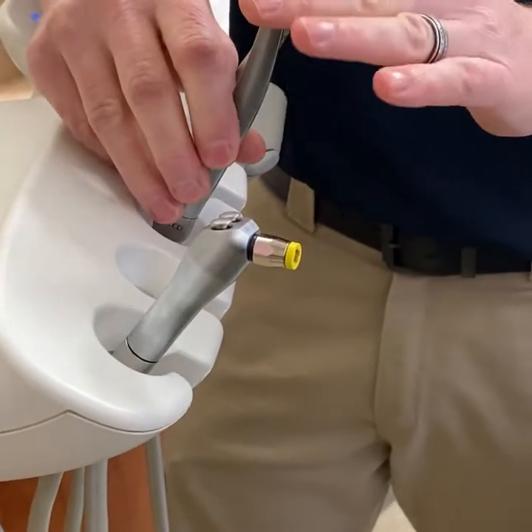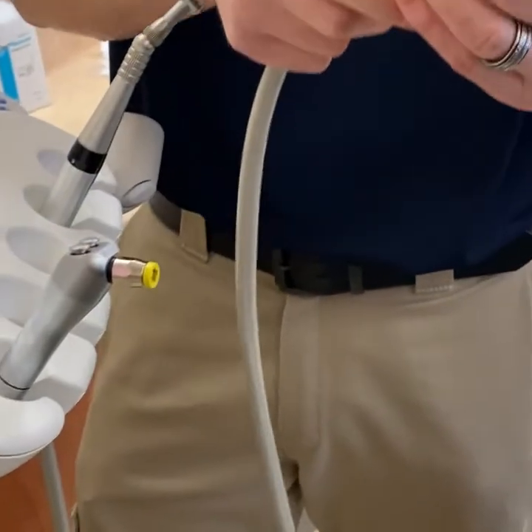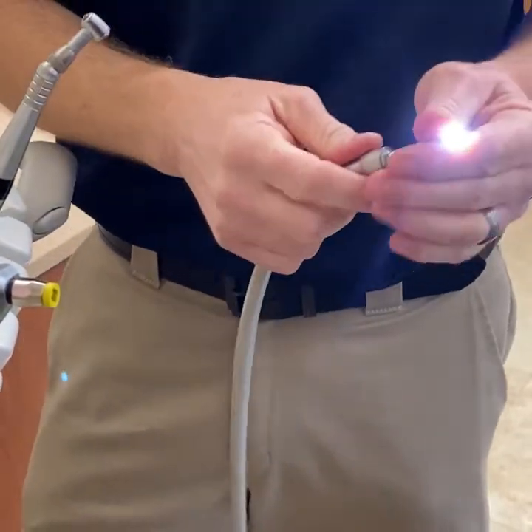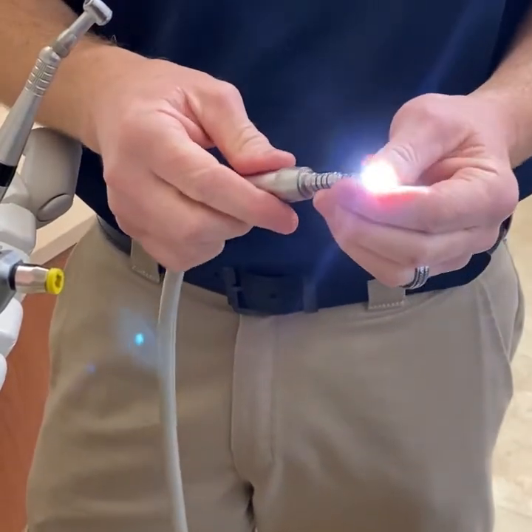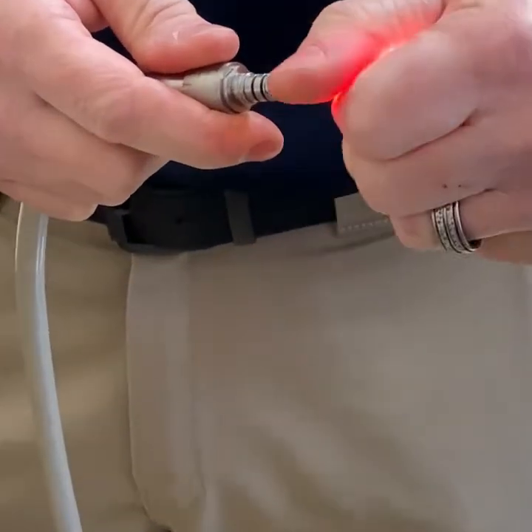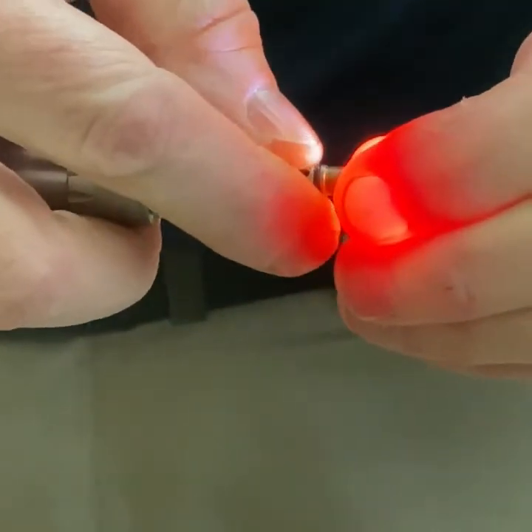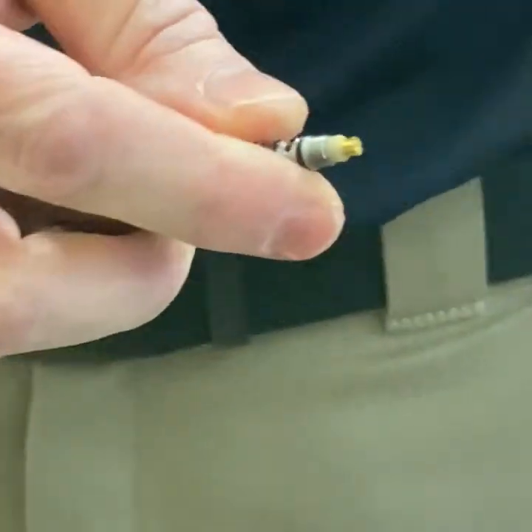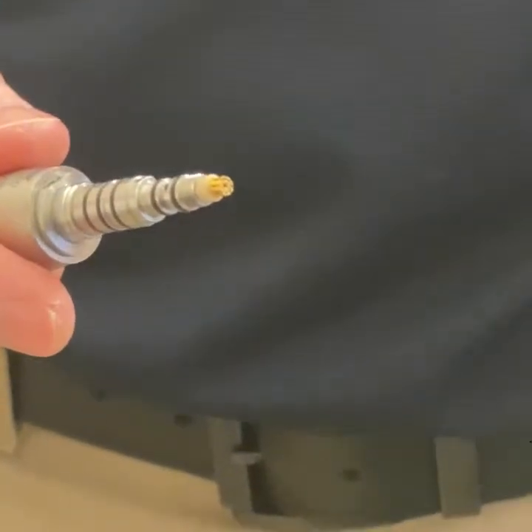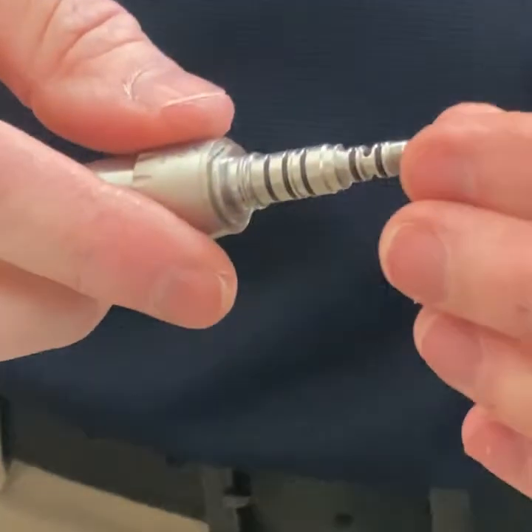Next I'm going to show you how to change the light bulb on your fiber optic handpiece. Remove the handpiece from the coupler — the top of it screws off. Set that little metal cap aside, and to remove the old light bulb just give it a gentle pull and it pops out. There are a few different styles of light bulbs; this one can't be put on backwards — there's only one way to install it.